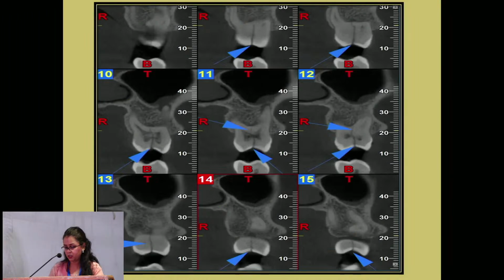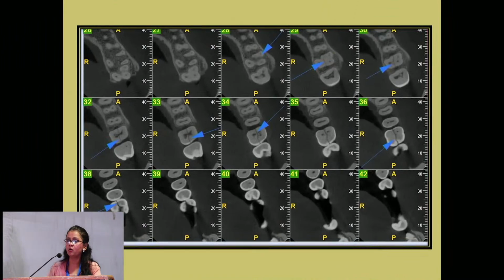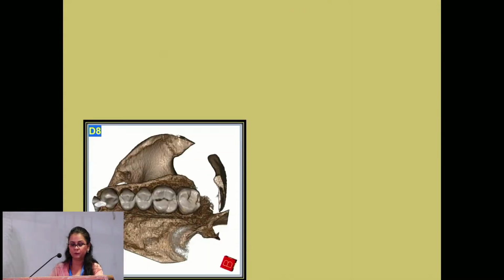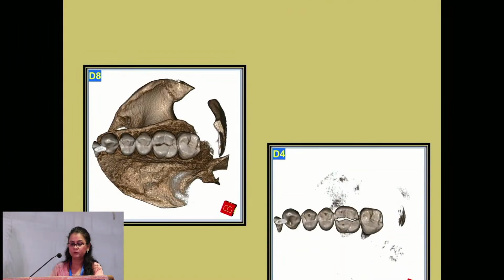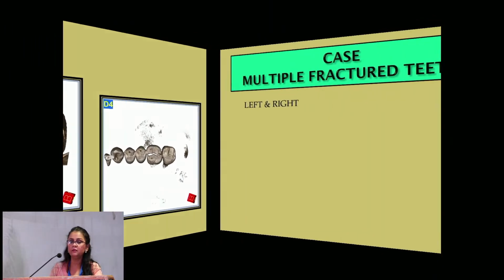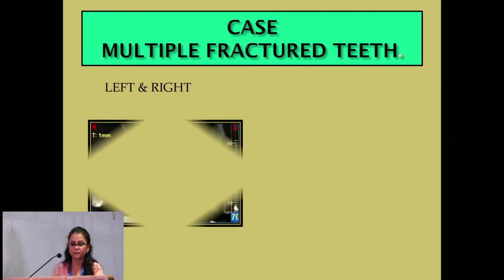This is the cross-section view, because you have to check, it might be an artifact also. So you have to see in the cross-section, in the axial section, in your 3D, mark it with an arrow, give a printout, create a PDF, generate a report, and then with the full proof, you are supposed to give the report.